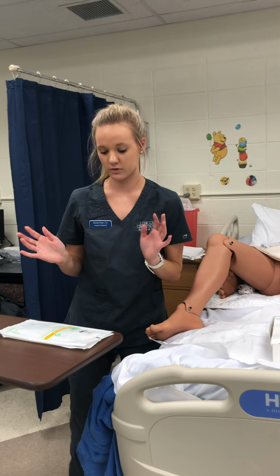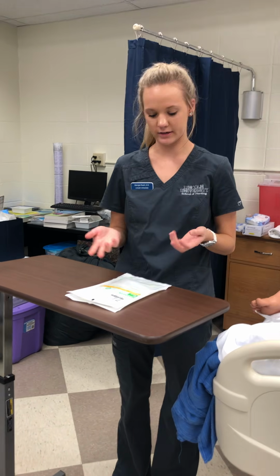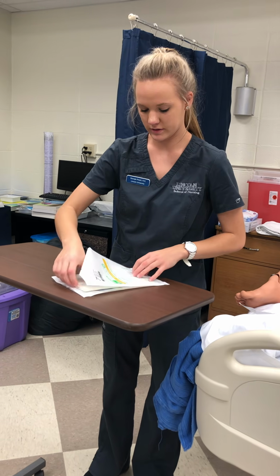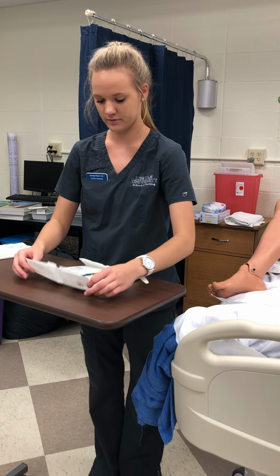Perfect. Now I'm going to go ahead and put on my sterile gloves. So I want to check the expiration date, and I want to check that they haven't been opened and tampered with. As well as if my patient had a latex allergy, I'd make sure I'd get latex free. Go ahead and open my gloves, making sure not to turn my back to my sterile field.